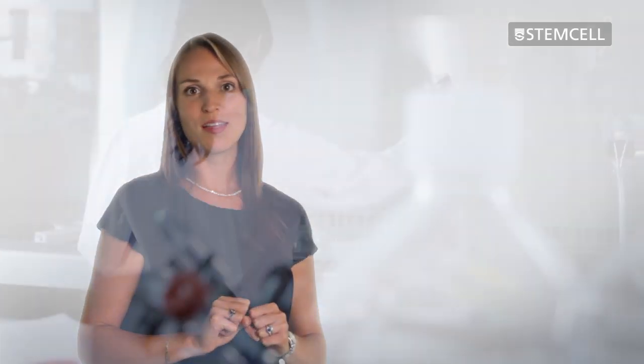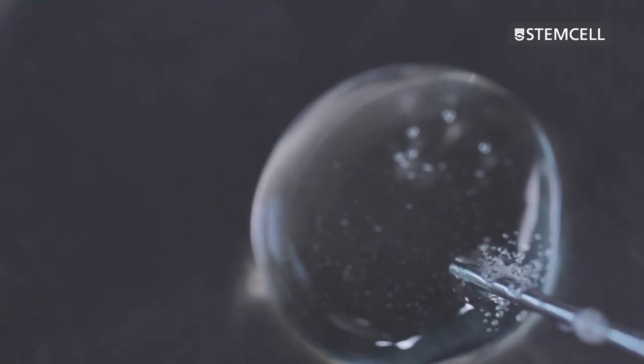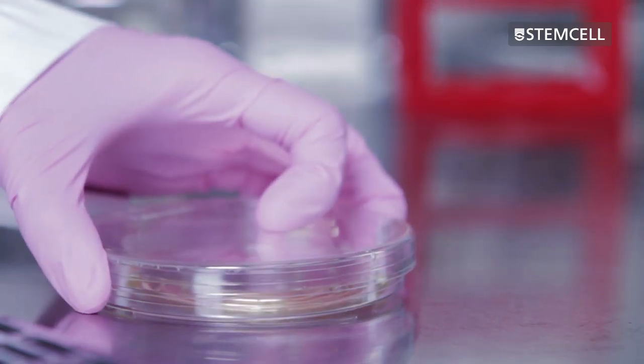In semi-solid cloning, individual cells are physically separated from each other by suspending them in a viscous semi-solid medium. Cultures are plated as a single cell suspension, with each cell immobilized within the semi-solid medium.